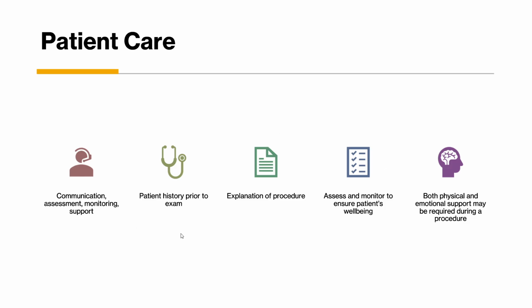You'll take a patient history prior to your exam. You'll explain the procedure in as much detail as you can, especially for those who have never gotten an x-ray, or sometimes you'll have kids that are getting x-rays done, and you'll have to explain to them what you're doing and that it's not going to hurt and all of that good stuff. You'll be assessing and monitoring the patient's well-being, especially if they are in a traumatic setting. They're just coming from a car accident or a fall or something along those lines, to make sure that they are still doing well throughout the entirety of the procedure.